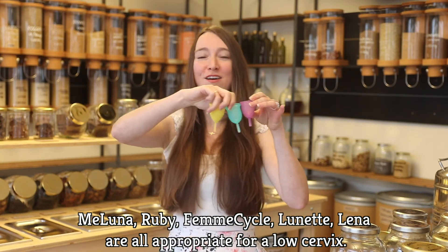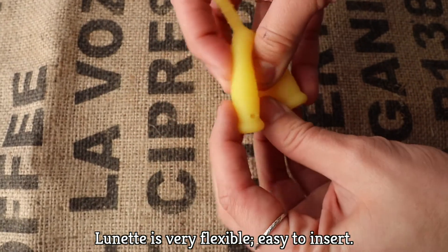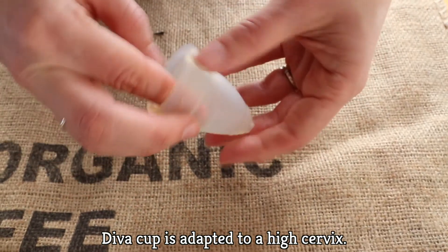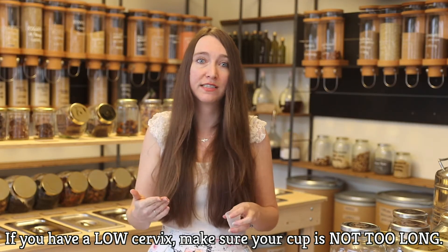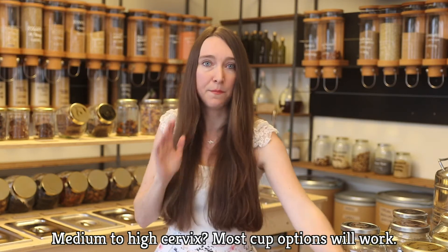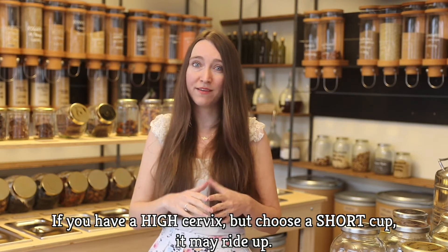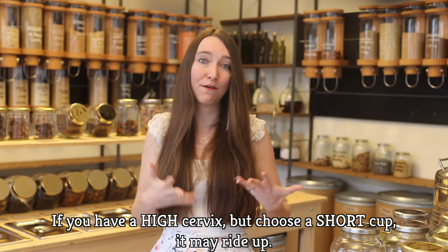These rainbow menstrual cups are all options if you have a low cervix. The yellow Lunette is particularly flexible, so it's really easy to insert. If you have a high cervix, a cup like the Diva One would work really well. It's mostly if you have a low cervix that you want to make sure your cup is not too long. If your cervix is medium to high, most options will be just fine. But if you have a high cervix and use a short cup, you might have to do some exploring to find your cup if it rides up, but it's nothing to be afraid of.